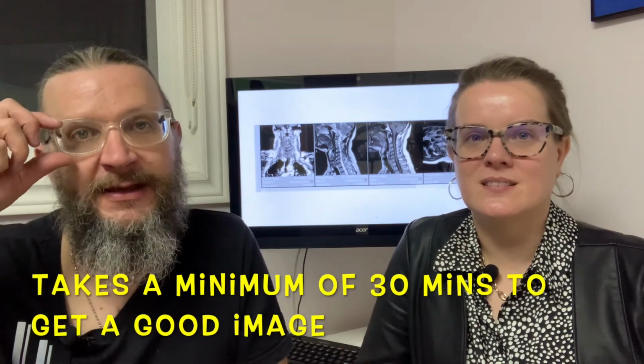The difficulty is there are some challenges with it. You do have to go into a very tight space. It's a lot more closed in than CT. So people who have claustrophobia or panic attacks or high anxiety oftentimes have to be sedated before they have this test done, or they may not be able to have the test done at all. And there are a lot of people, myself included, who don't think they're claustrophobic until you're in that tube, and then you realize you do have a claustrophobia issue. And you have to be in the tube for such a long period of time as well to get the visual images.